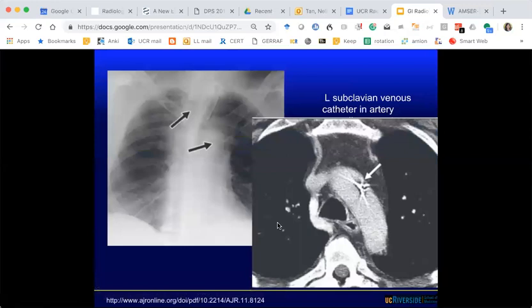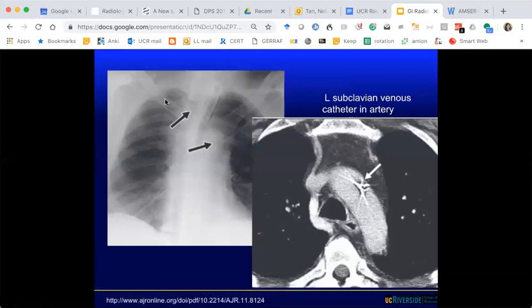Here was a quiz question — a central venous catheter, the PICC line, going in. Most said it's in the aorta, so definitely not in the right place. You have to be careful — look at the color of the blood coming back, it shouldn't be bright red, and it should not be pulsatile. If any of those things are evident, you need high suspicion for malpositioned catheter.